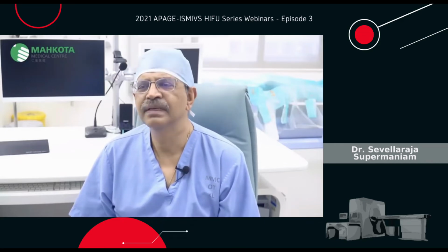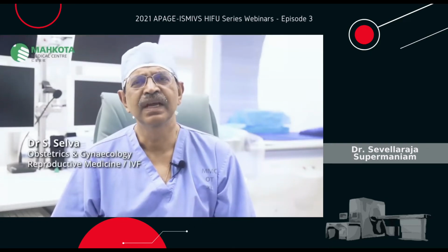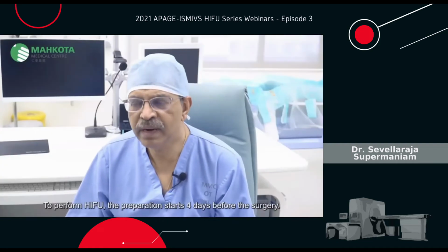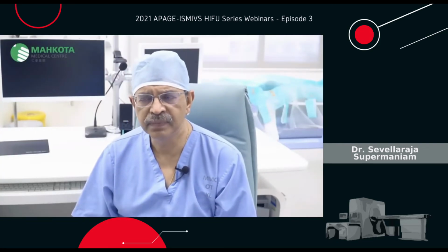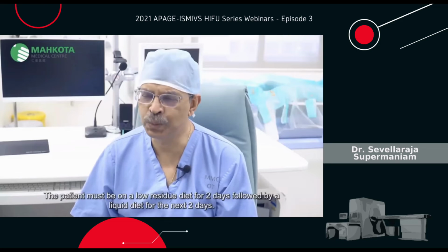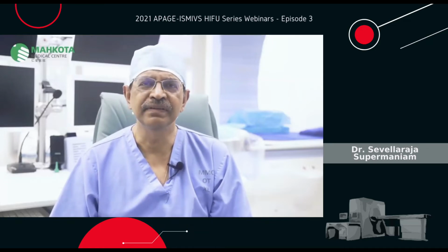Hi, I'm Dr. Selva, consultant obstetrician and gynecologist of Mahkota Medical Center, Malacca. Let me share with you an overview of high-intensity focused ultrasound or HIFU. To perform HIFU, the preparation starts 4 days before the surgery. The patient must be on a low residue diet for 2 days, followed by a liquid diet for the next 2 days. She will be given an enema 12 hours before the surgery for bowel preparation.